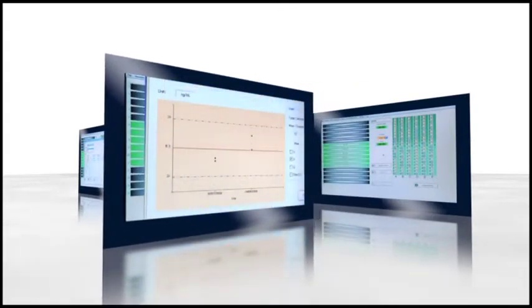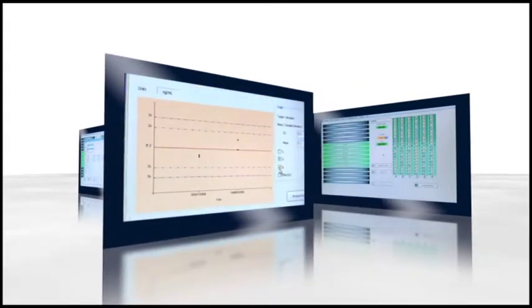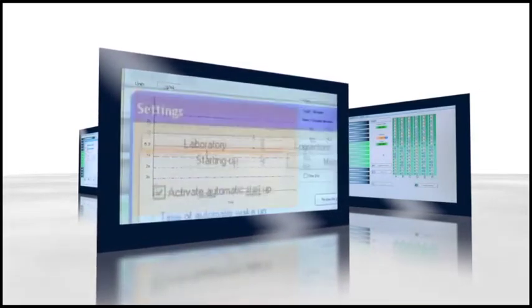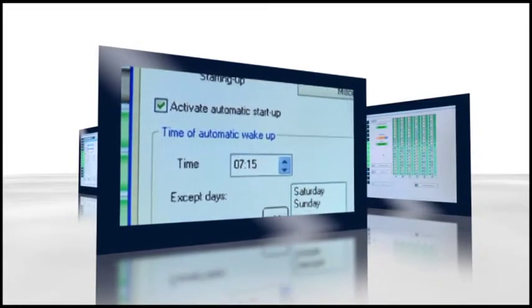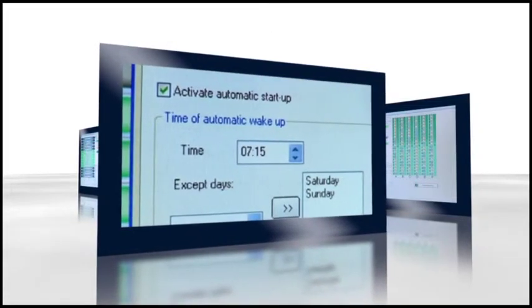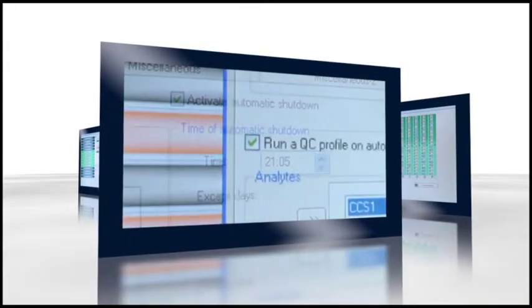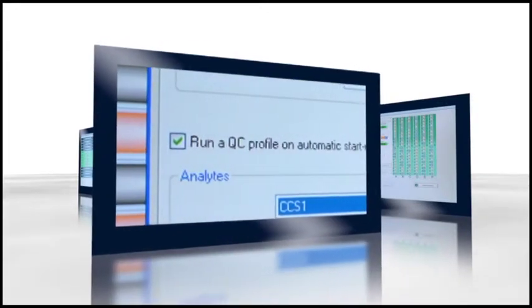The quality controls are managed utilizing Westgard rules and familiar graphical charts such as Levey-Jennings. Routine system maintenance is monitored and scheduled through its alarm clock function. The IDS Isis can perform most of its daily maintenance and QC checks before the working day has begun.